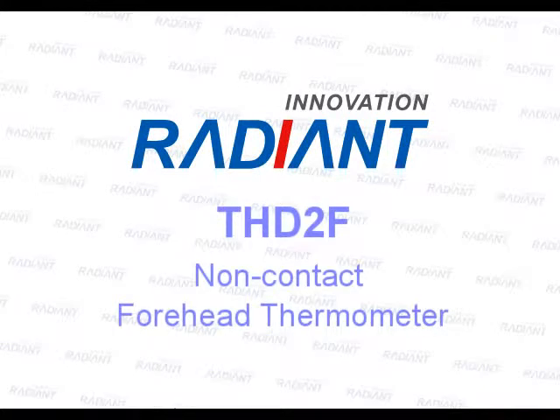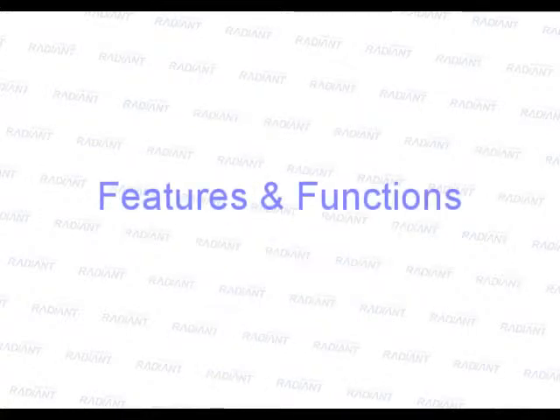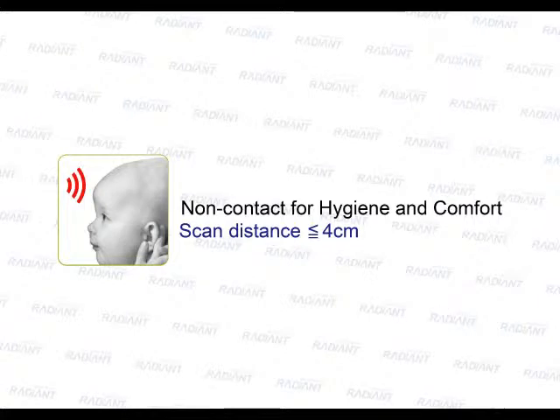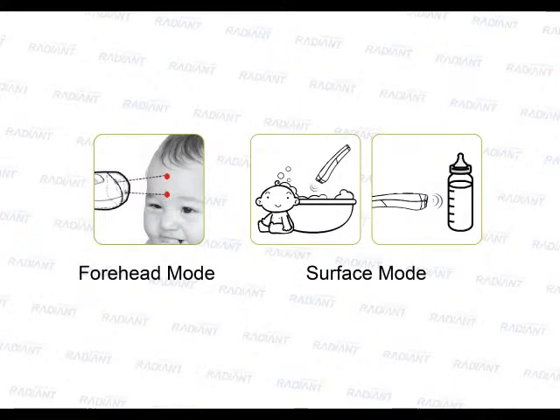Operation instruction of the non-contact forehead thermometer. It features a dual LED dock for the correct measurement distance, non-contact design for hygiene and comfort, and one-second forehead measurement. The device supports two modes: forehead mode and surface mode.